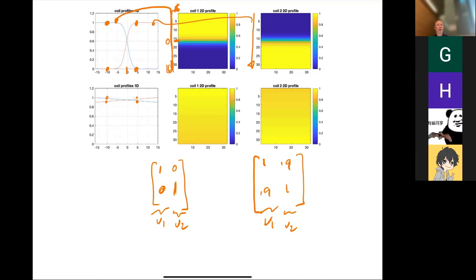It can be quite complicated, especially at 3 Tesla, where the wavelength is still slightly bigger than your object. But as you go higher, the wavelength of the RF becomes on the order of your object, so now you have to worry about weird reflections. It's great if you like E&M, and it's good that there are people who know how to do it too. So it becomes a lot of E&M simulation.